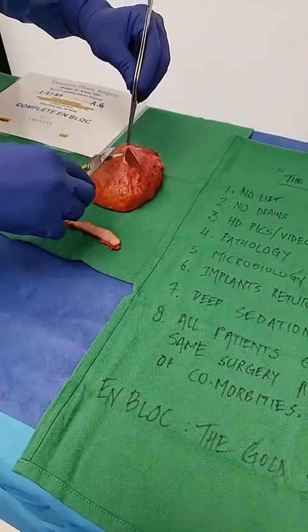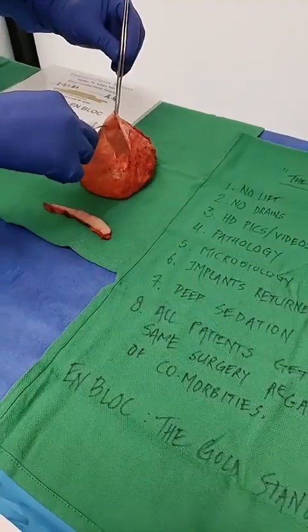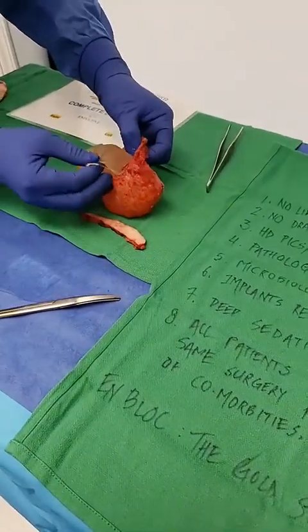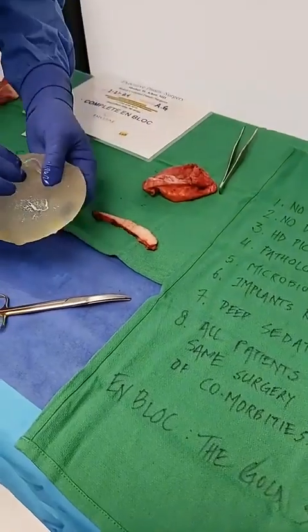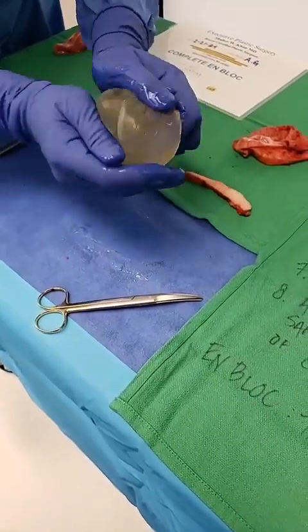So as I go in, same thing I see over here. These are intact, and good for her, these are intact up there so far. And you can see the formation of a secondary capsule here. And look at this, a lot of fluid around. If I go like this, these are my new gloves. I basically have a new pair.